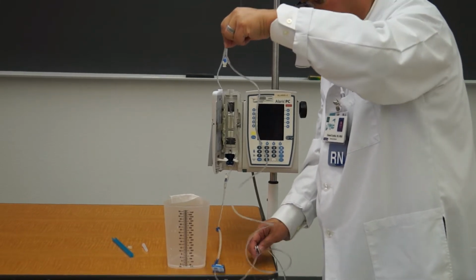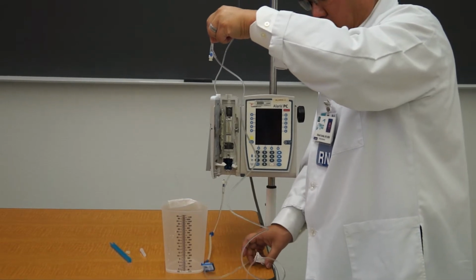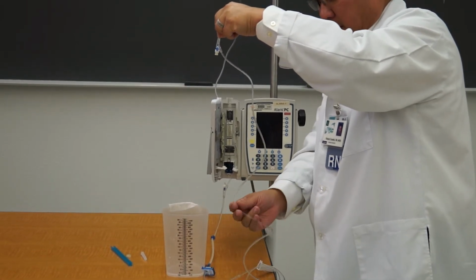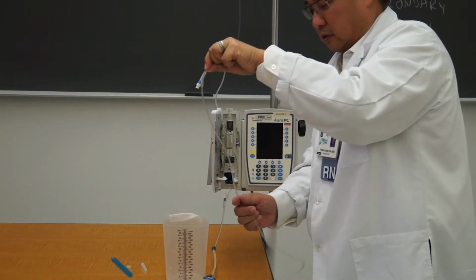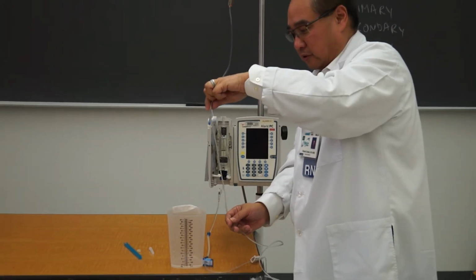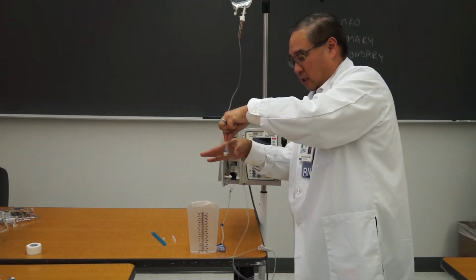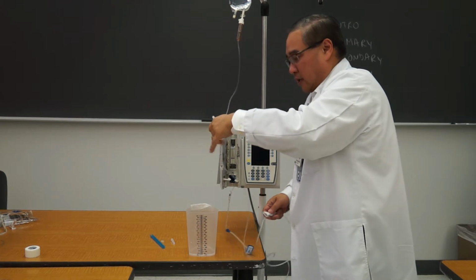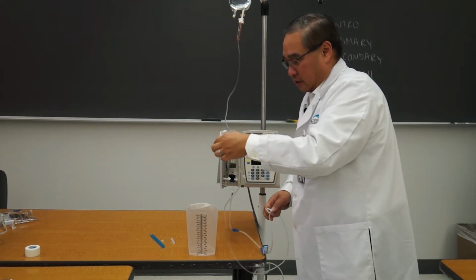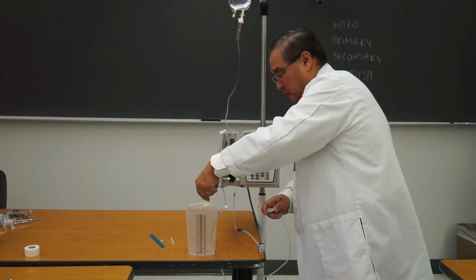I'm going to speed up a little bit here. See, there it goes. And that's how fast you go; you don't have to go really fast to get this done. See, I'm going to get closer here. When I get to the Y site, I'm going to start flicking it. There you go. No bubbles. Get my thing ready here, and the air bubble is right there near the tip. Hold it over a trash can.